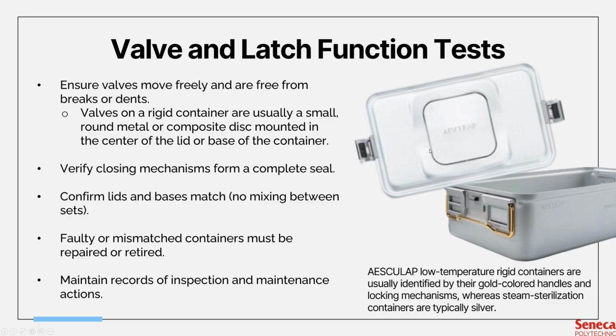Any container with faulty or mismatched parts must be repaired or permanently retired from use. And you have to keep a record of all inspections, repairs, and maintenance performed for compliance purposes. So this is very important for you to know. Gold handle is for low temperature. Any silver latches and silver handles are for steam or higher temperature sterilization methods.